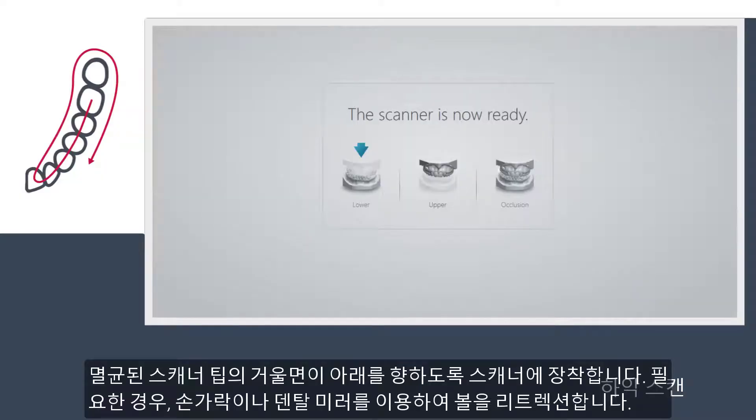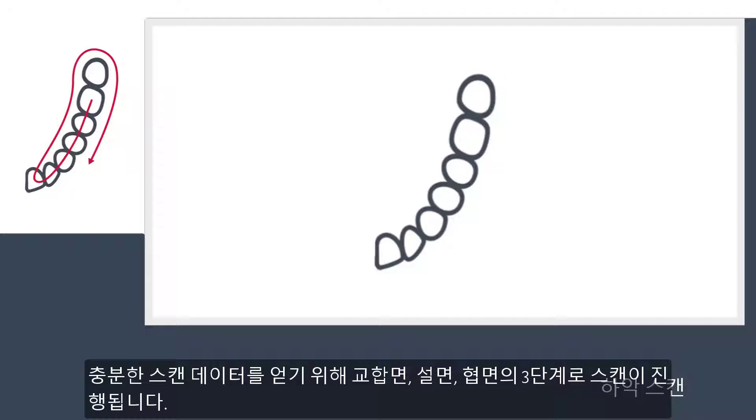Place a clean scan tip on the scanner with the mirror facing down for lower arch scanning. Use your finger or a dental mirror to create space between the teeth, lips and cheeks if required. The official scanning strategy consists of three swipes — occlusal, lingual and buccal — to ensure good data coverage of all surfaces.